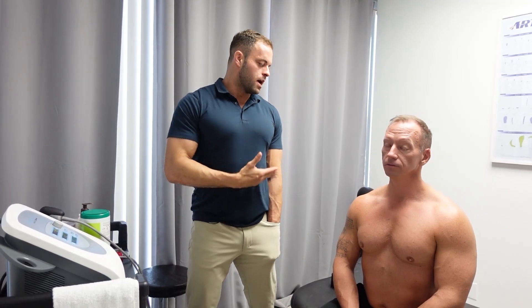As you can see, the guy's been to the gym a couple of times, so he's had some wear and tear on his shoulder from years of lifting. He's also a chiropractor, so he's bent over working on patients — we have some job-related orthopedic stress as well. So I'm going to use the Shockwave on the shoulder and show you at least a fragment of the treatment.